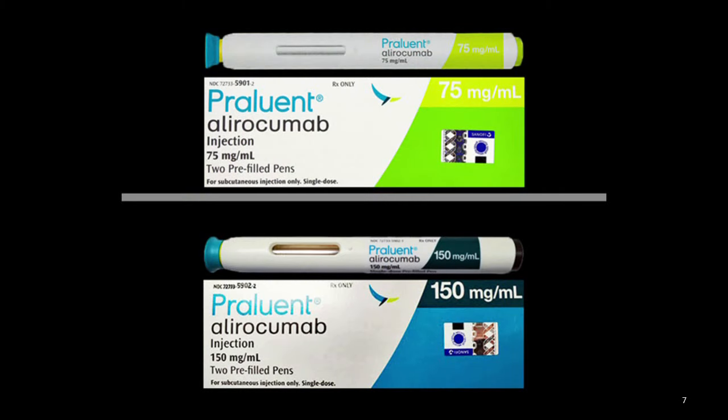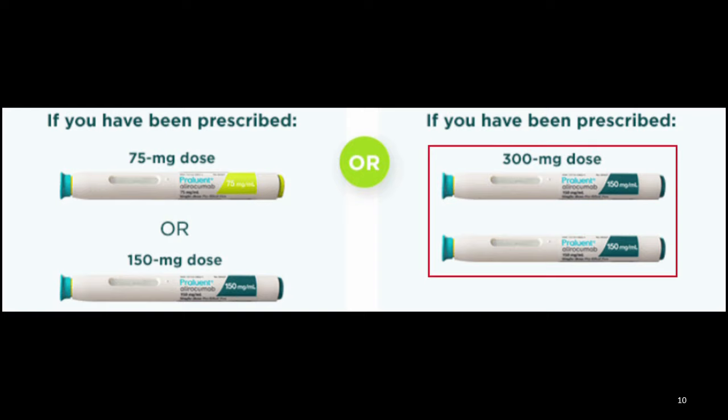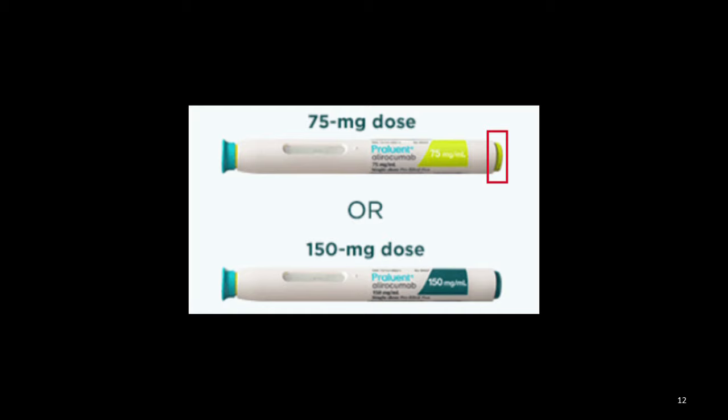If you don't have the medication yet, this is what it will look like. Aliracumab autoinjectors come in two different doses: 75 mg dose and 150 mg dose. If you need to give yourself a 300 mg dose, you will need two 150 mg dose autoinjectors as two separate injections. The 75 mg dose autoinjector has a green activation button; the 150 mg dose autoinjector has a gray activation button. The dose of 75 mg, 150 mg, or 300 mg, and the schedule of every two weeks or every four weeks, is determined by your VA provider according to your healthcare needs.